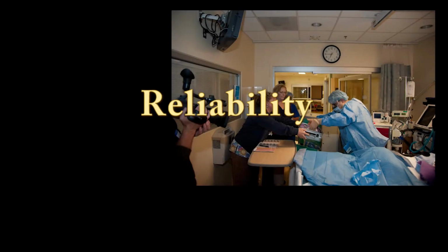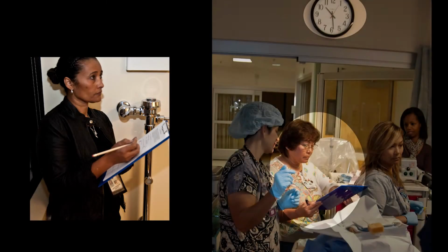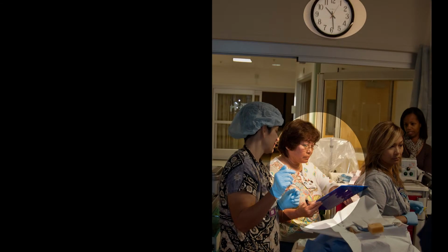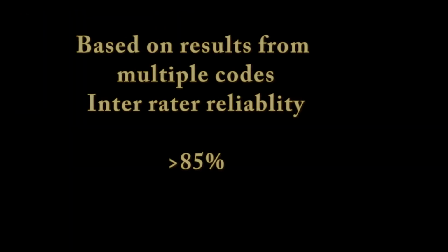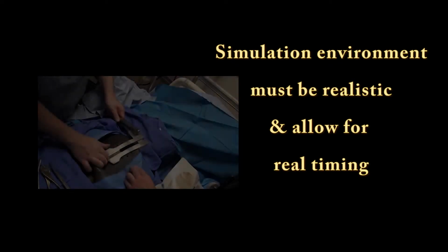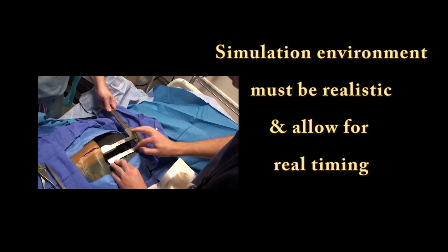The question being asked here, will the tool deliver similar results when used by different observers? To test for inter-rater reliability, we had multiple observers use the audit tool during a mock code and then compared the results for consistency. For timing, we also compared the observers' results with the time as determined from video. Inter-rater reliability was found to be greater than 85%. The audit tool will only be useful if your simulation allows the team to perform all of the steps in the procedure outlined in the tool in real time.